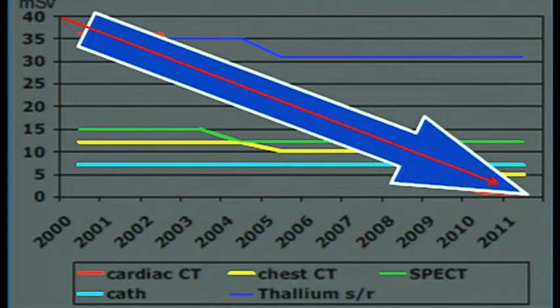The most positive point about coronary CT angiography is that it is non-invasive, involves a very short examination time of around 9 to 10 seconds, and gives you very good quality 3D images in a single breath hold and a single contrast injection. So why not do a coronary CT angiography in each and every patient? There are some issues, the major being the radiation, which was very high with previous scanners.